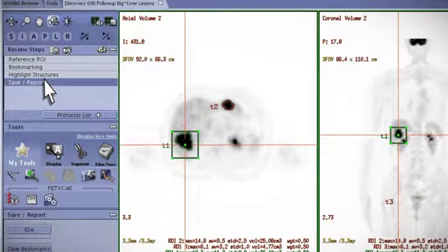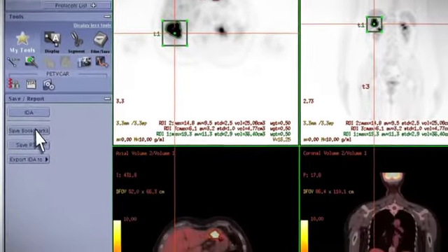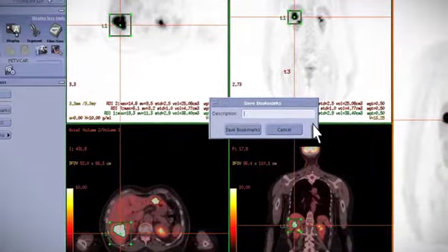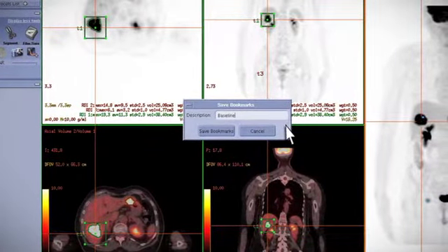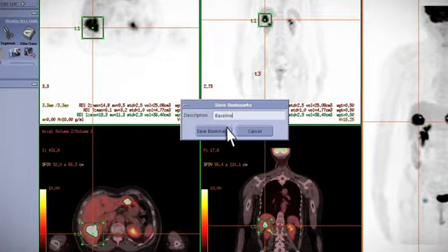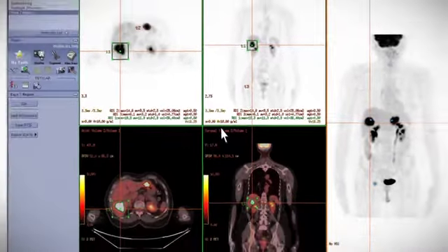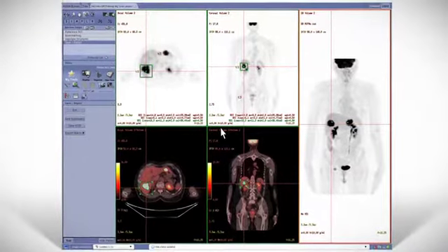These bookmarks can be saved with information about the lesion, like the functional volume, SUV for future follow-ups, and radiotherapy structure sets for collaboration with radiation therapy planning.